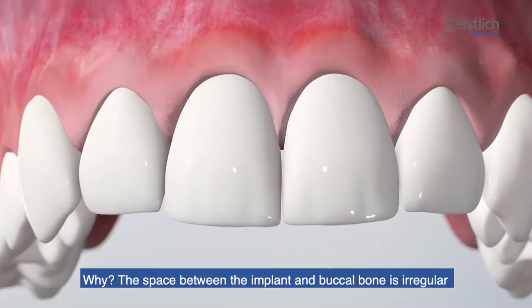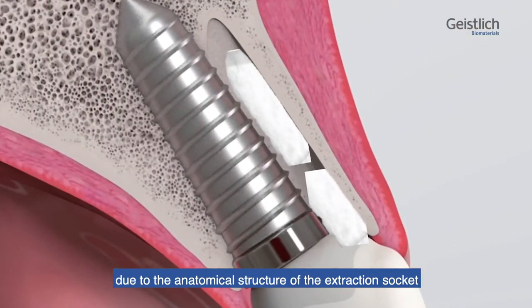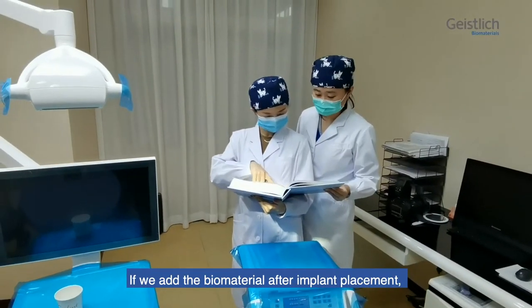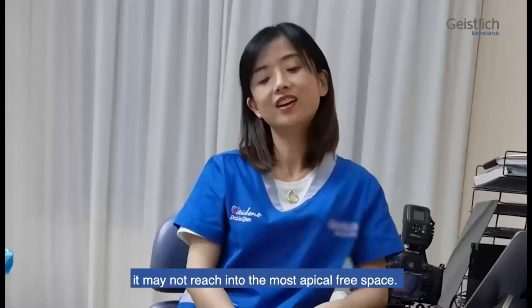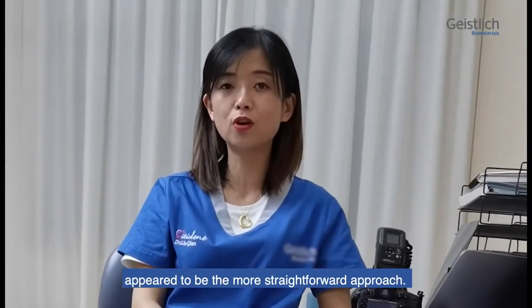Why? The space between the implant and the buccal bone is irregular due to the anatomical structure of the extraction socket and the implant geometry. If you add the biomaterial after implant placement, it may not reach into the most apical free space. Therefore, bone augmentation in advance appears to be the more straightforward approach.